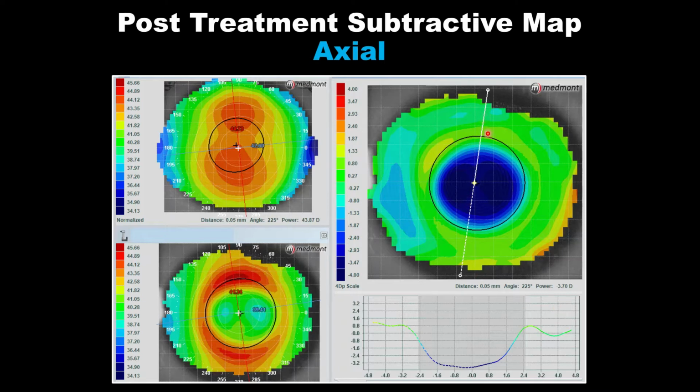We can look at this axis line to assess the powers distributed within the pupil, and that's this gray area you see here, most minus in the center, least minus in the periphery, indicating to us we're creating a good myopia controlling shape. We're pushing the plus into the pupil as much as possible.